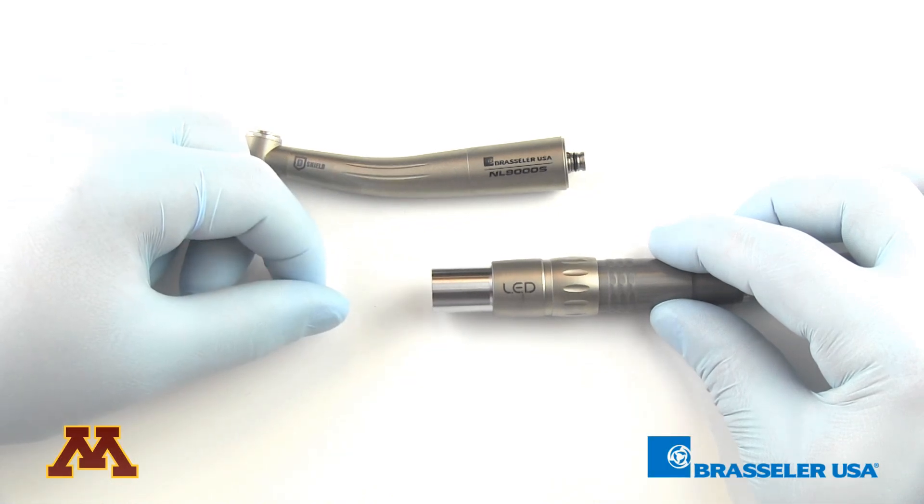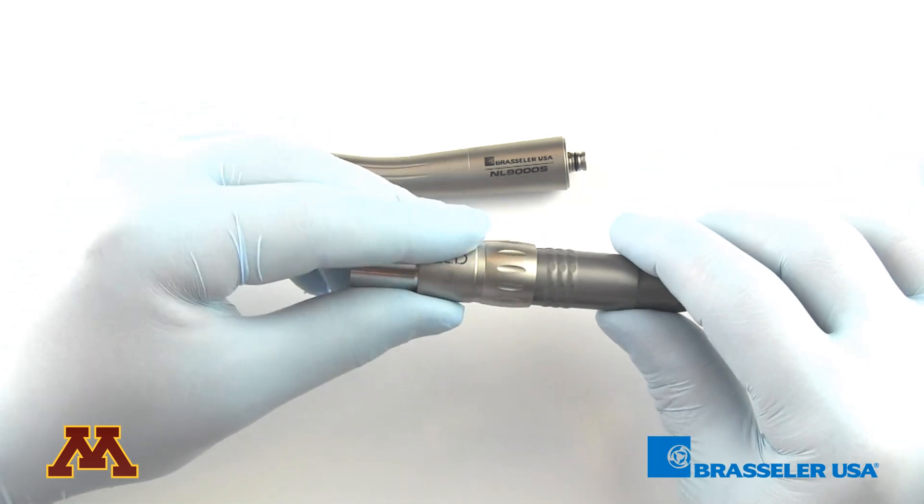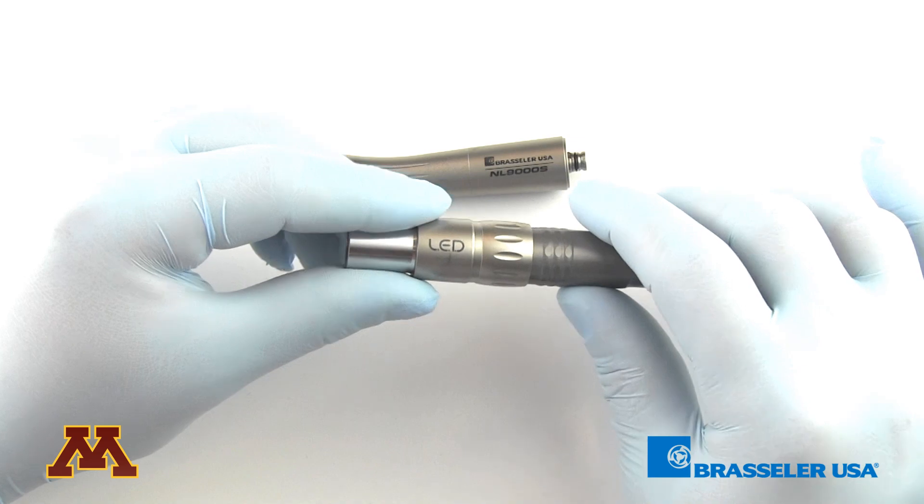This is a quick overview of the hand pieces that are used at the University of Minnesota's dental school. One thing you'll notice is a coupler that's connected to the very end of the dental tubing. This coupler should remain on the dental tubing at all times.